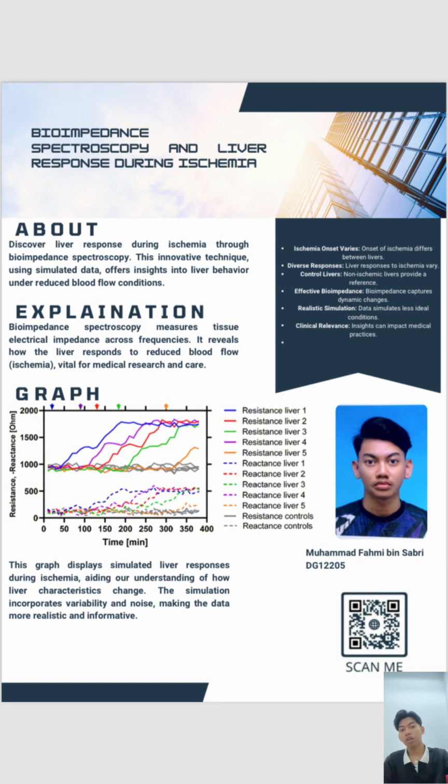We are currently conducting a clinical study to validate BIS for monitoring liver response to ischemia in patients undergoing liver surgery. We are also developing a BIS-based device that can be used to monitor liver function in real time. We believe that BIS has the potential to improve the management of patients with liver ischemia and other liver diseases.